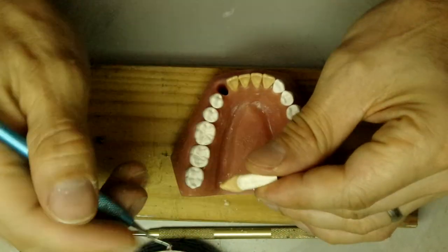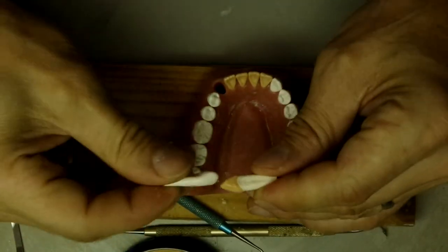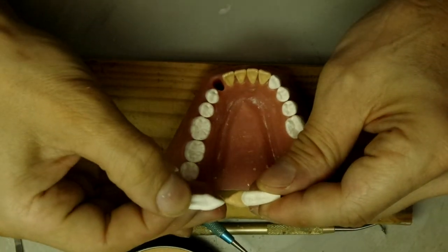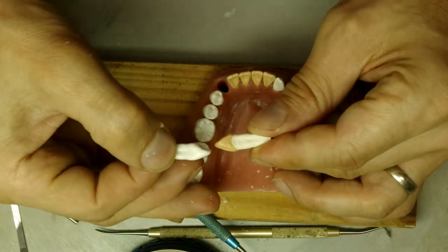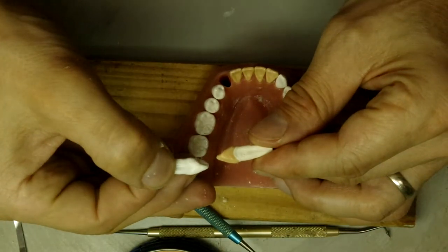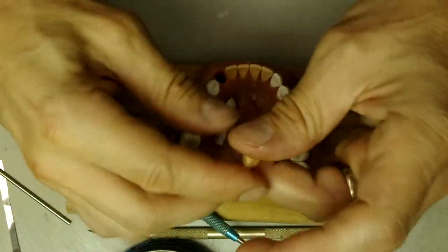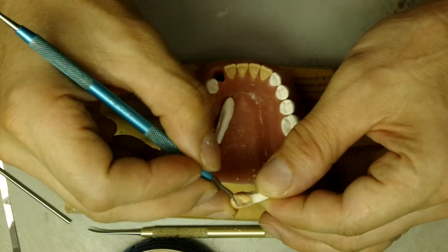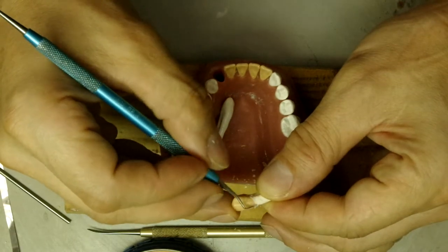So now you have to make sure that we match up with the tooth, with the original tooth right here. See how over there I'm a little bit too fat, so we're gonna have to take that back a little bit. So we'll take a little bit off the what? The height of contour.